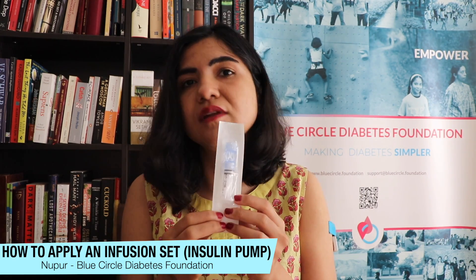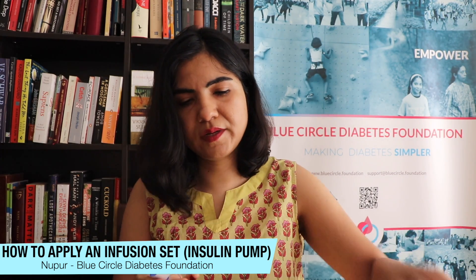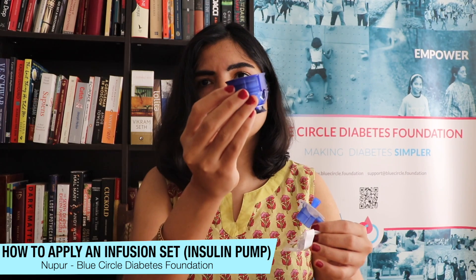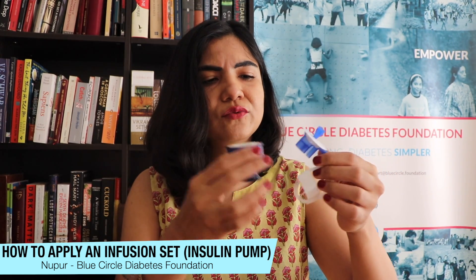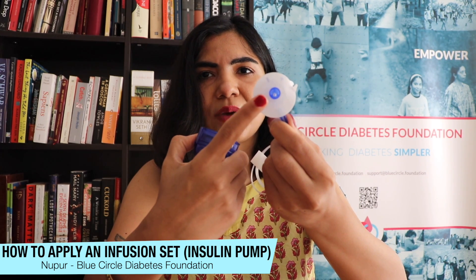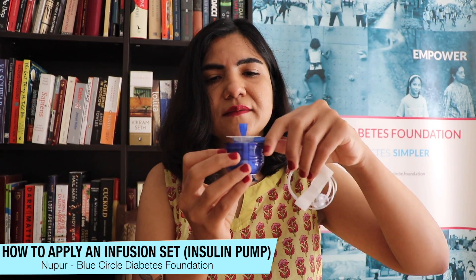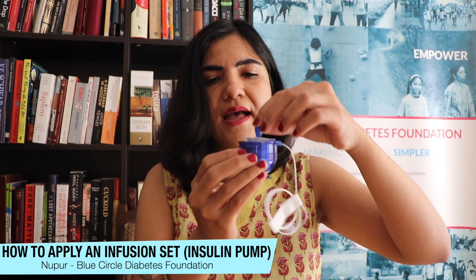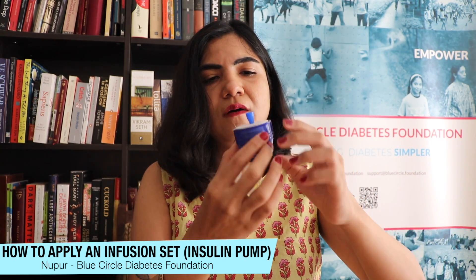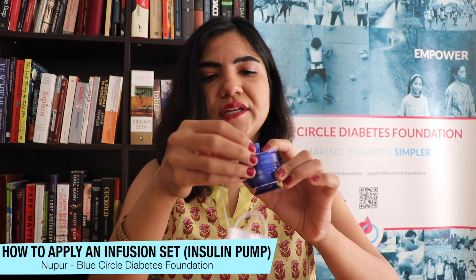What I'm going to do next is open this packet up and fit it into the Serter. This is what the patch looks like — the blue part is where the needle is. You fix it into the Serter, align it like this, and push it in a little bit. You'll see a paper cover and a sticker on the top that you need to remove.